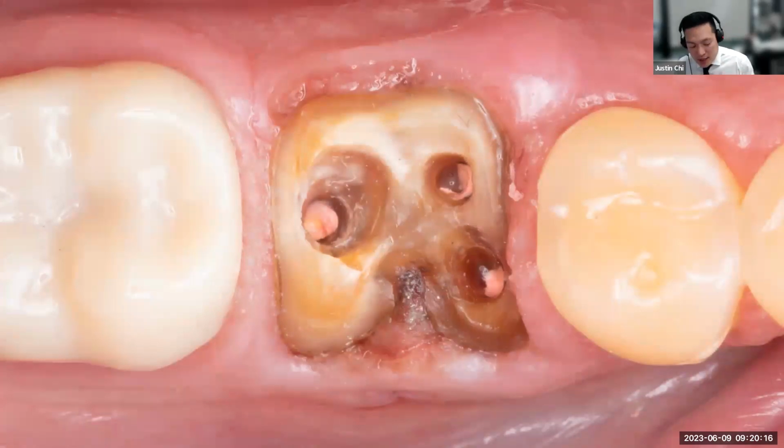All right, so back to the situation, wanting to evaluate whether or not there is furcal involvement. And as you can see, there was pretty extensive furcation involvement, and we want to ideally unroof that zone. There was inflamed tissue there. A lot of times with these bilayered materials like porcelain fused to zirconia or porcelain fused to metal, PFM crowns, those restorations can often be very bulky, especially if the preparation is under-reduced along those furcal zones, or really any part of the preparation.